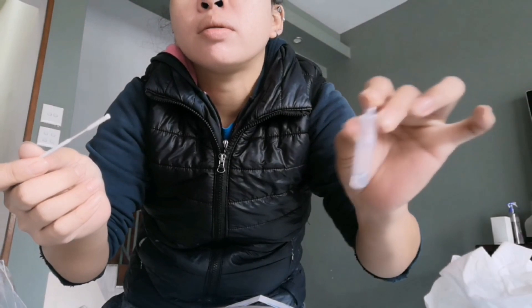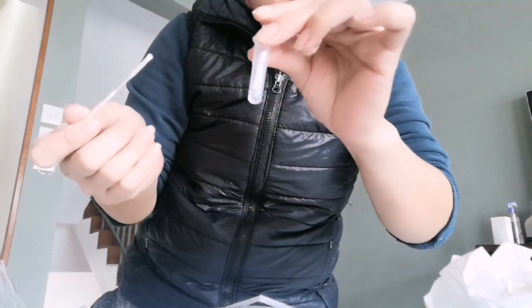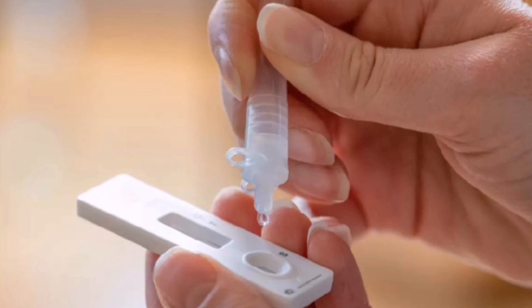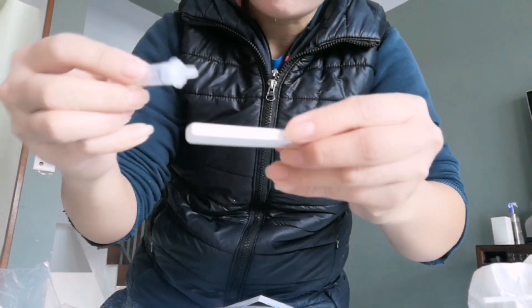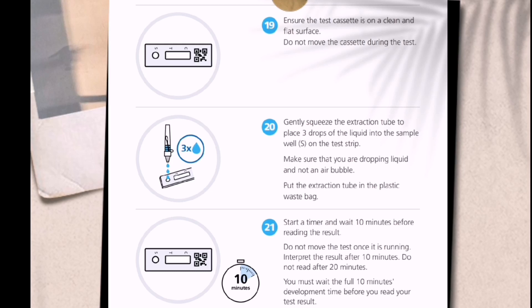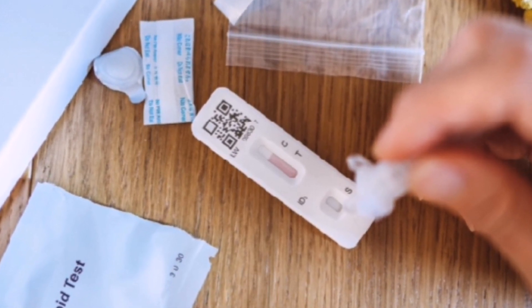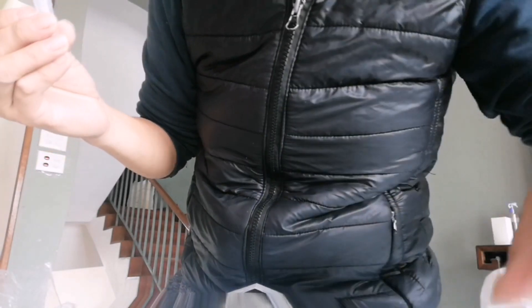We are getting ready for the dropping of the mixture. Yung liquid — after we use the swab, properly dispose it. We'll start 3 drops sa test cassette — we'll count it: one, two, three. 3 drops ng liquid from the extraction buffer tube. We'll wait for about — sa amin we waited 15 minutes exactly. Place the test cassette on a flat surface and wait for the result.